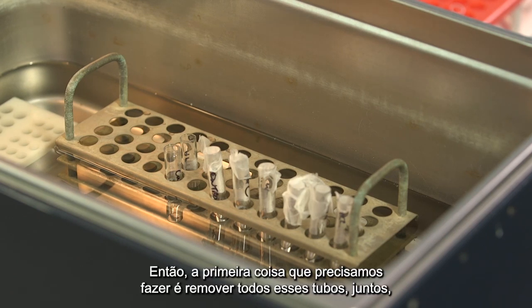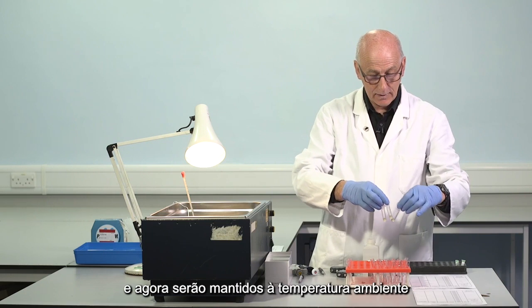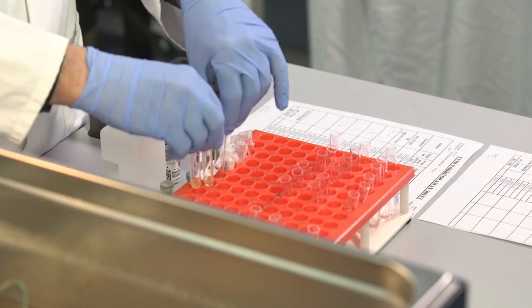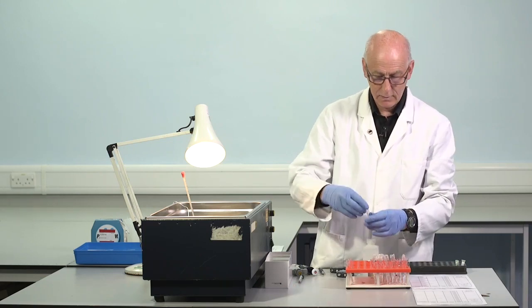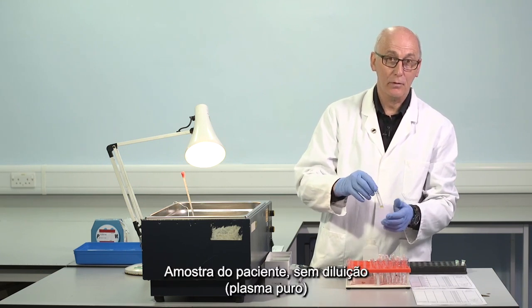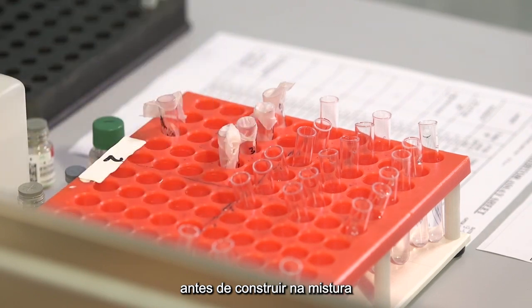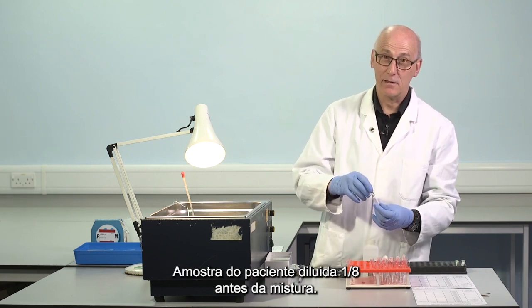So the first thing we need to do is to remove all of these tubes together from the 37 degrees water bath, and these are now held at room temperature during the period of assay. So we have a control mixture, IQC, patient sample not diluted, neat plasma, patient sample diluted 1 in 2 before constructing the mix, patient sample 1 in 4 before the mix, patient sample 1 in 8 before the mix.